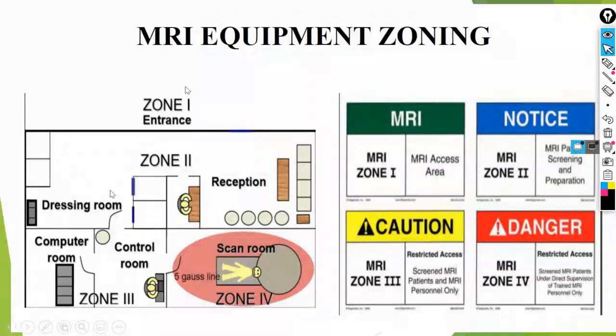Zone 1 is the entrance area before the patient enters the reception area, which is completely outside and accessible to the public without any issues. This zone is marked in green.